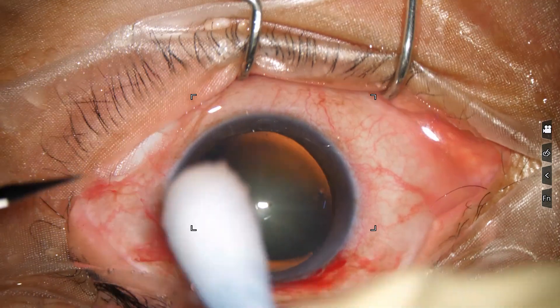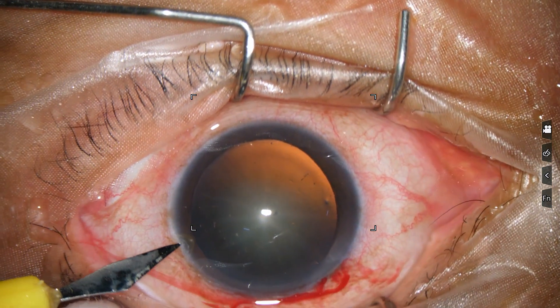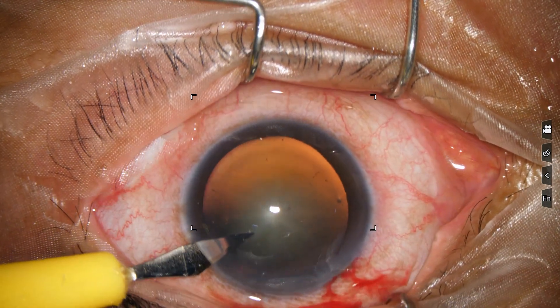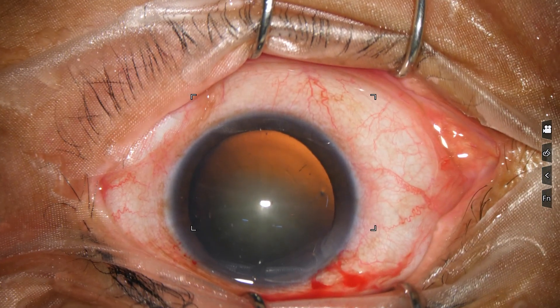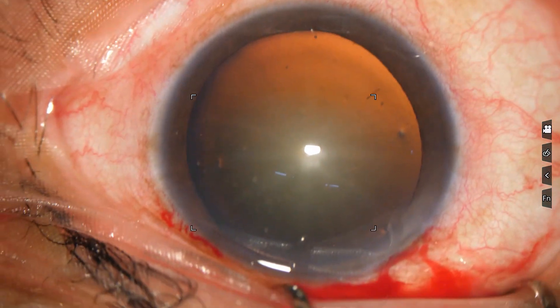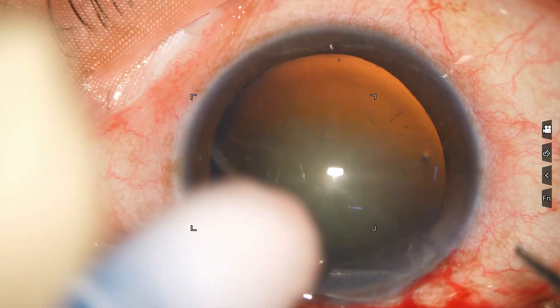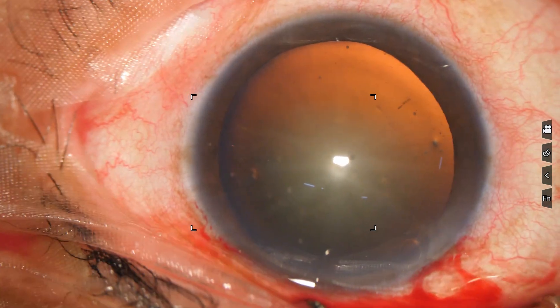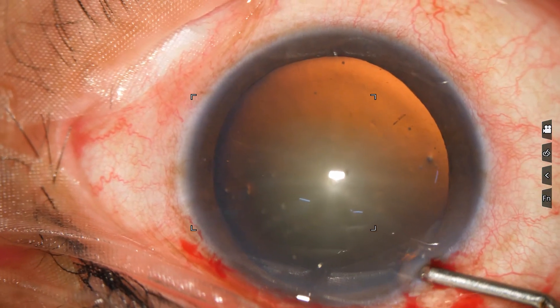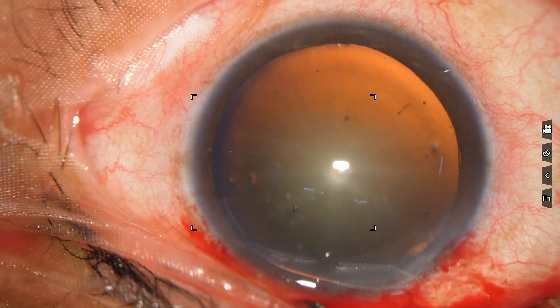A side port is made about three o'clock hours away from the main incision. Width of this side port is about 1.7 millimeters. The side port is 90 degrees away, and the astigmatism produced by the main incision is neutralized to some extent by the side port.